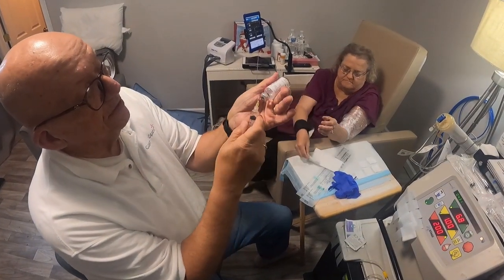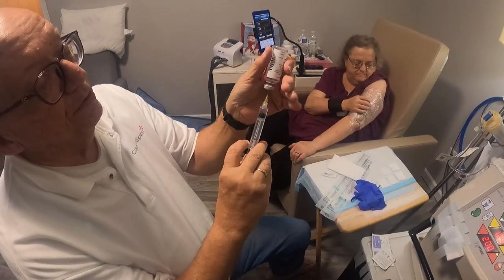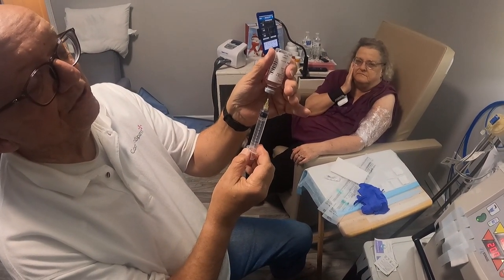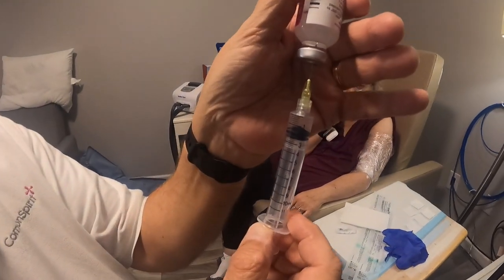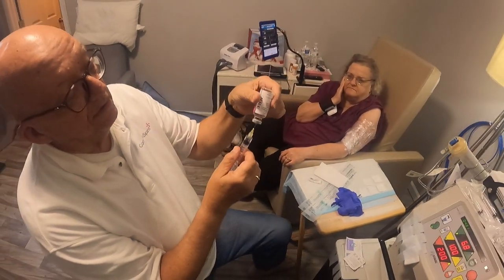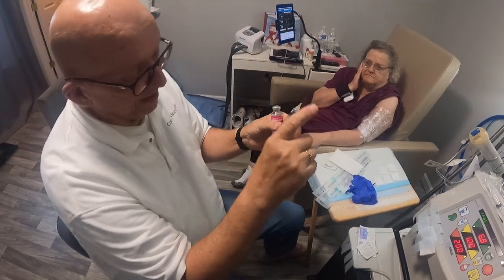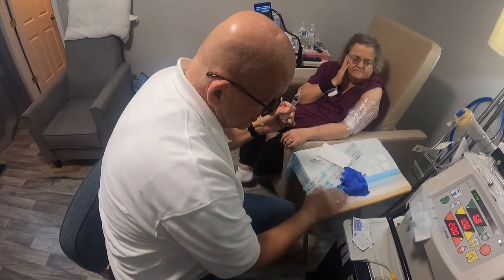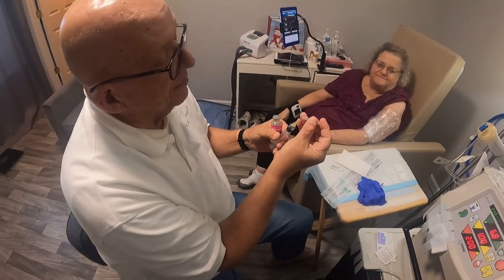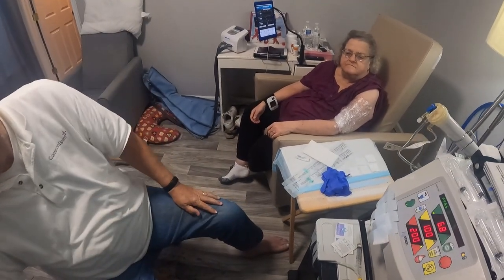Then I preloaded this, punch that through, push this in. It'll inhale it most of the way. And most of this stuff, if you flick it, it'll push all the air to the top. And you'll see what we do with that in a minute. What I do with my little business. Leave that right there. Just put it back in the drawer.